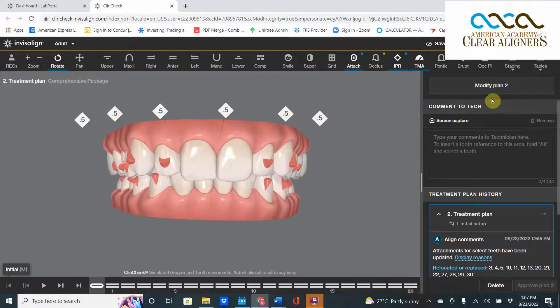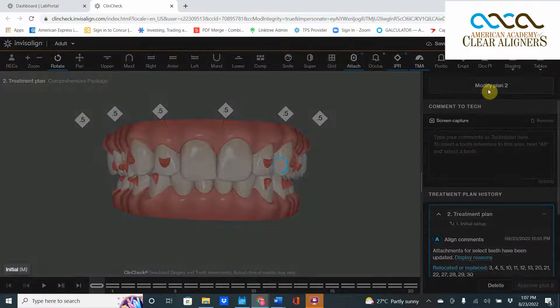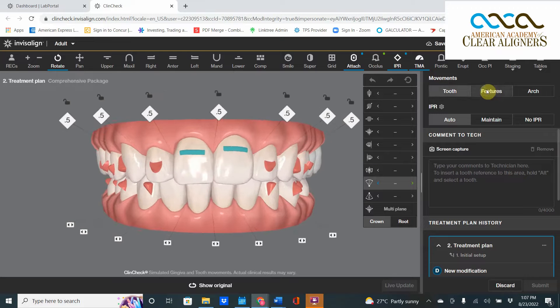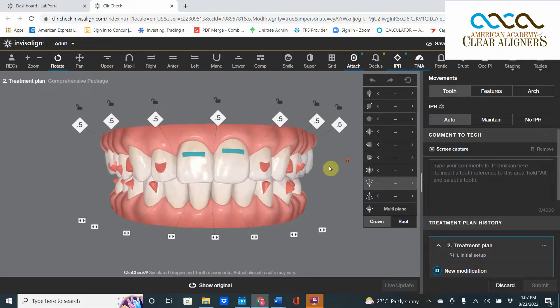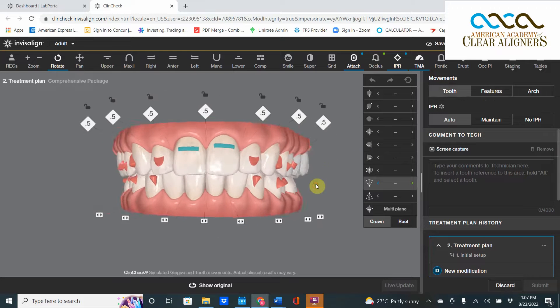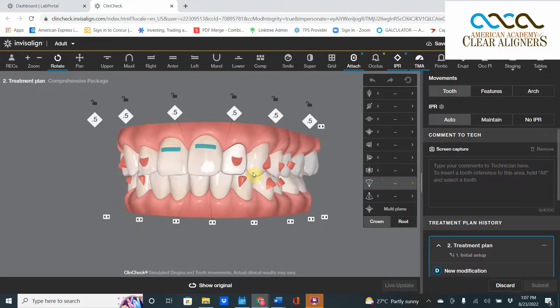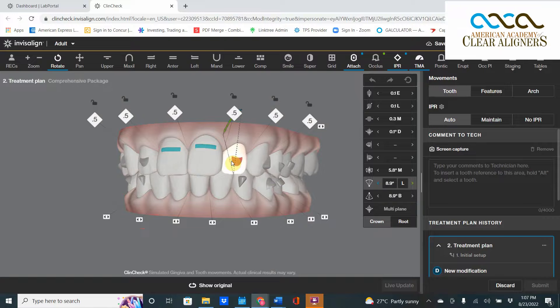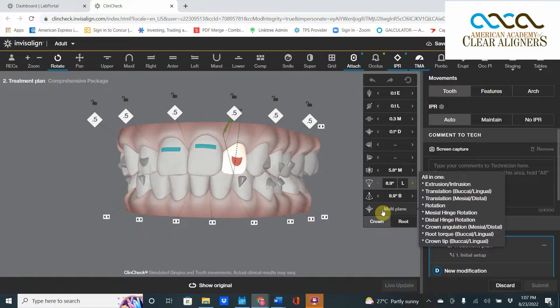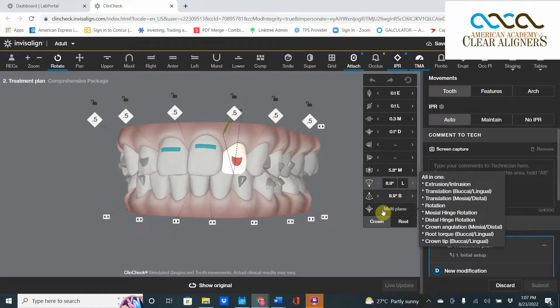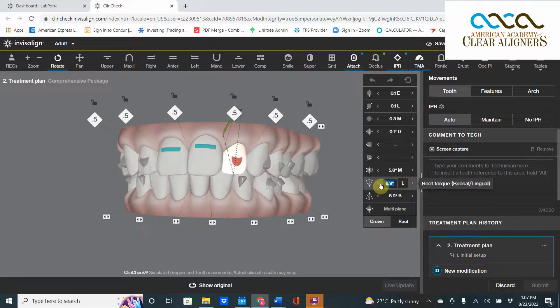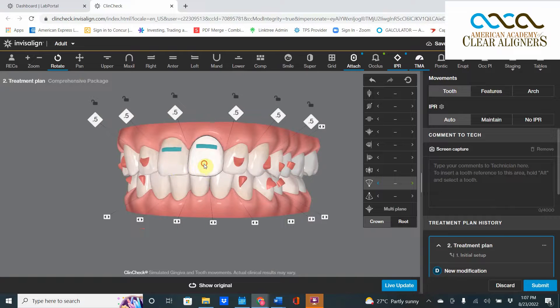So let's go to the videotape. We go to this thing called Modify Plan 2, now we're in the 3D controls. We hit the incisor. The one that we're looking for is the third button from the bottom - one, two, three. That is root torque.